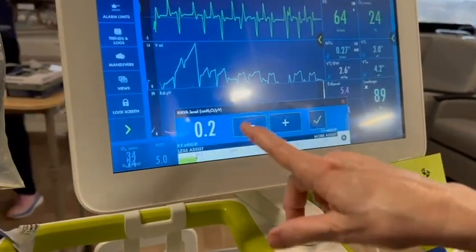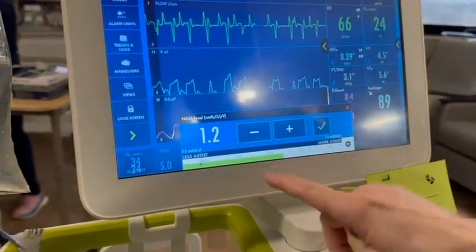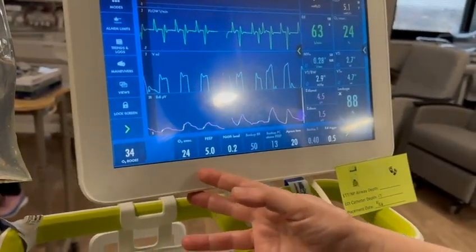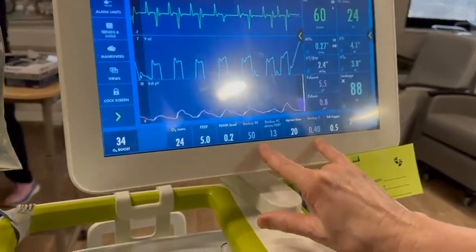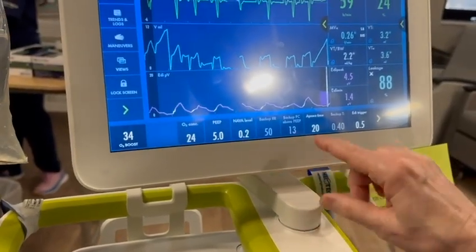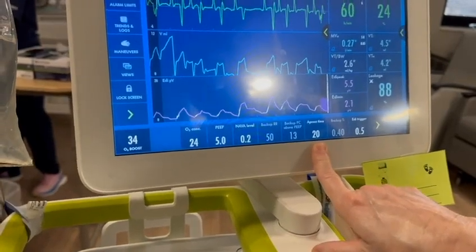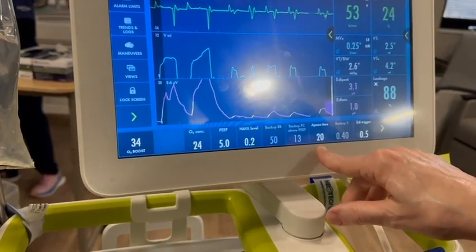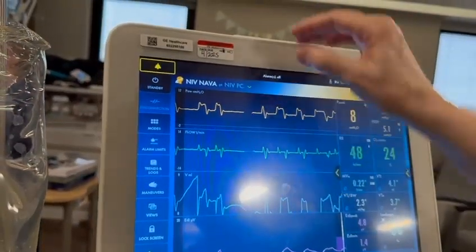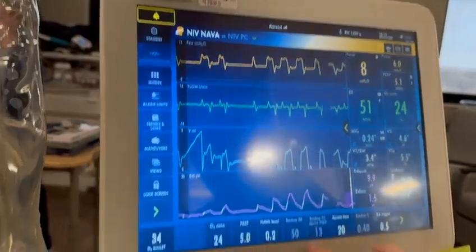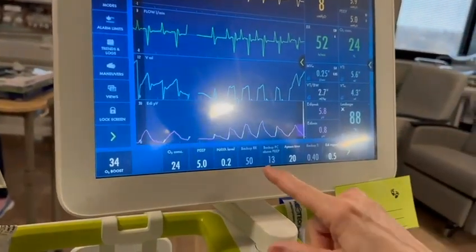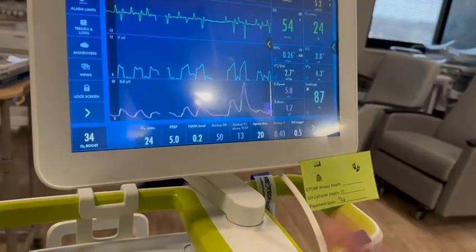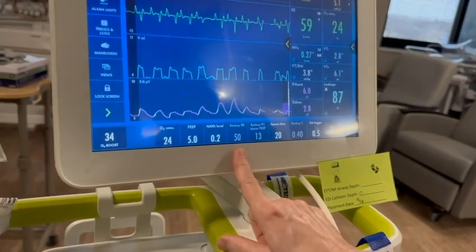We literally just set levels — higher levels mean the machine does more work; lower levels mean the baby does more work. We set a PEEP and an oxygen concentration, then set backup settings. If the baby does not breathe for a specific set time — here the apnea time is set to 20 seconds — the machine flips into backup mode using pressure control, delivering non-invasive puff ventilation to stimulate breathing. Otherwise there is no set rate; it is all what the baby does. If the baby goes apneic, it is controlled at whatever rate is set for the backup.